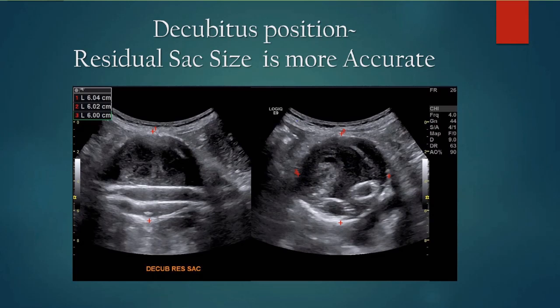It's very helpful. And if you are able to get an accurate measurement in decubitus, that's helpful too, to use that size measurement.